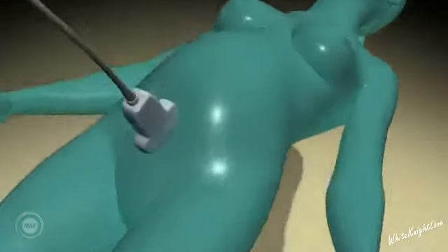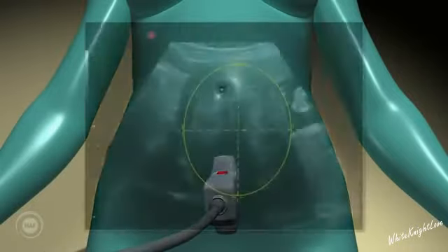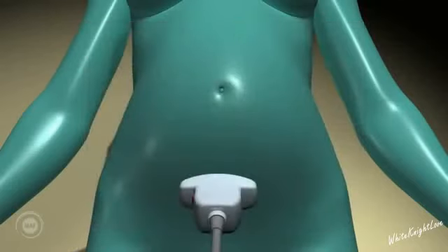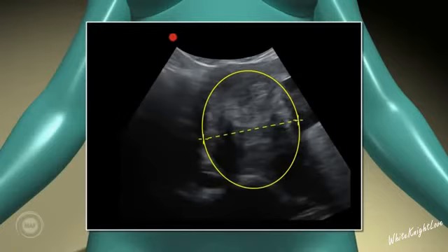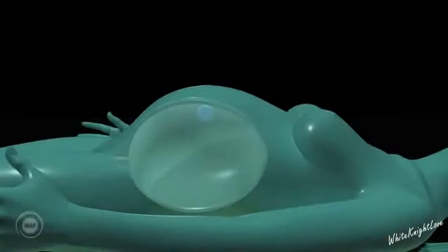Fibroids. When scanning fibroids, it's important to describe their size in terms of volume. Two measurements are taken in the longitudinal plane and one measurement is taken in the transverse plane. The fibroid should then be located in relation to the uterus to determine whether it is fundal, anterior, posterior, or cervical. Also described as the fibroid's position within the uterine wall.